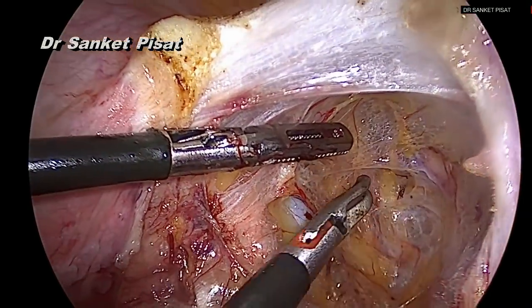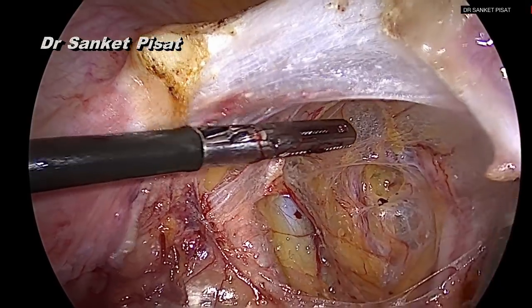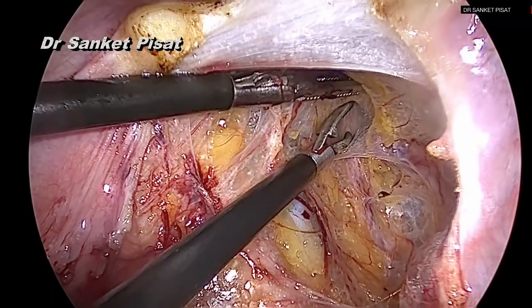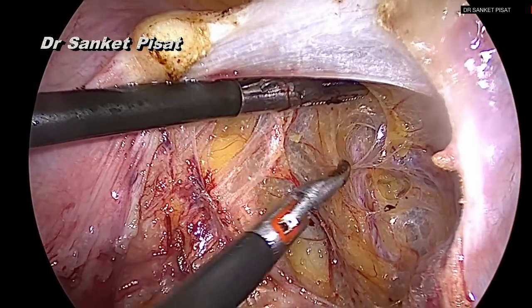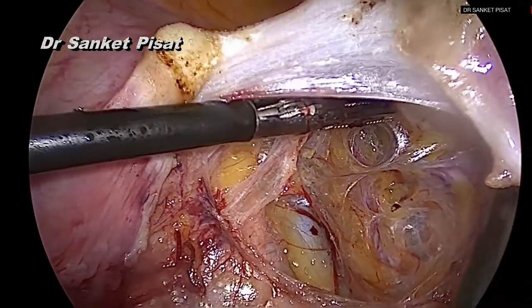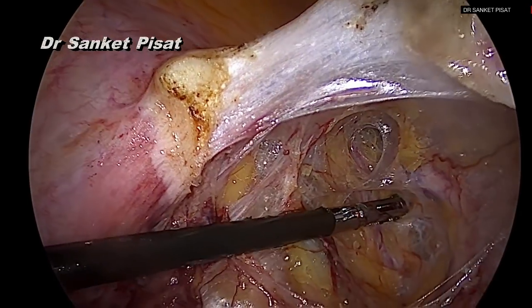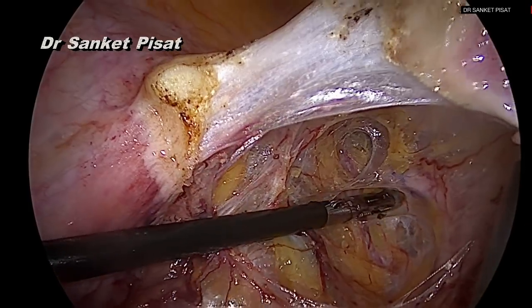The uterine artery at this point is the first structure to cross the pararectal space from the lateral side to the medial side. Therefore we perform a dissection in order to find this structure which is crossing the pararectal space transversely. These uterine vessels have now started becoming apparently visible.